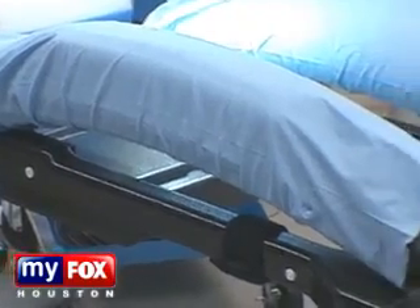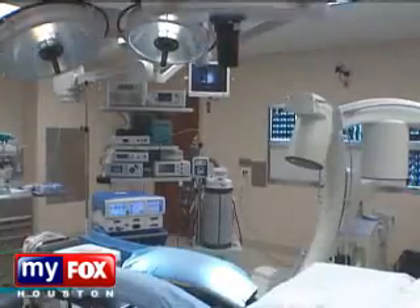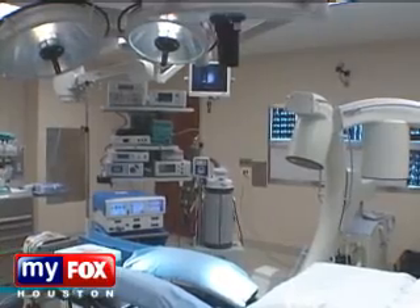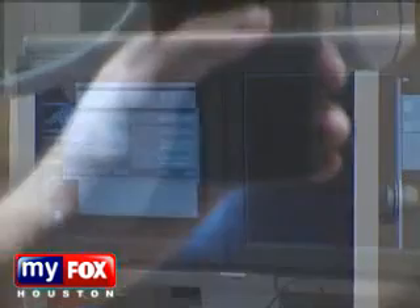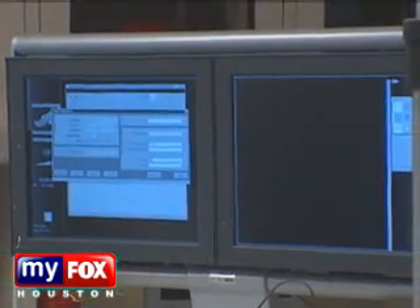Check out the surgical table, especially equipped for this procedure. It's called a Jackson table and has a carbon fiber frame. We can take x-rays from the front, from the side, or at any angle without the table actually interfering with the patient, so we have a full 360-degree view of that patient's spinal anatomy.